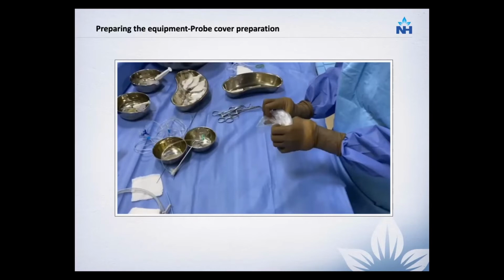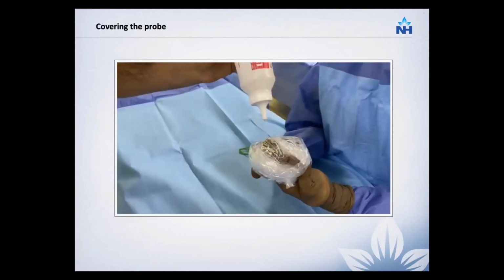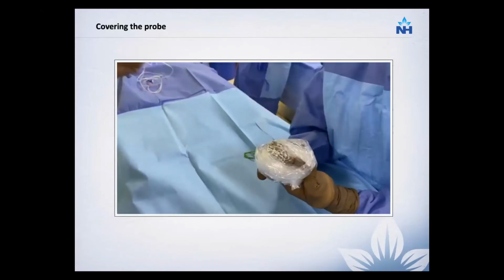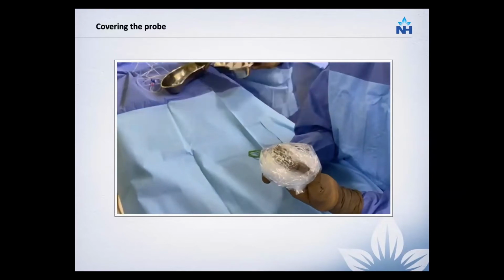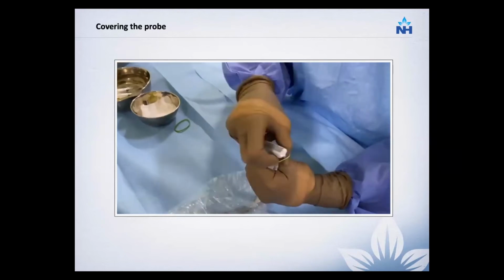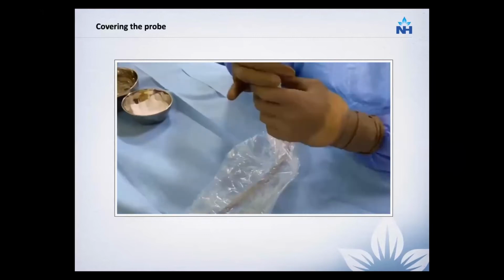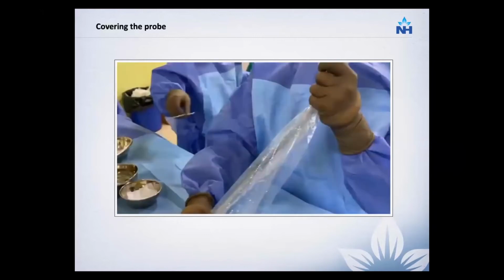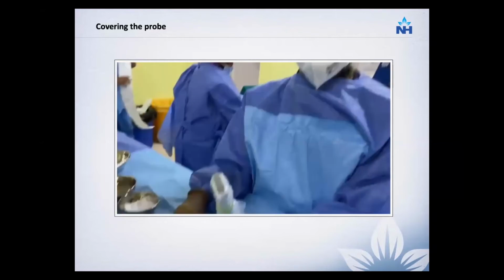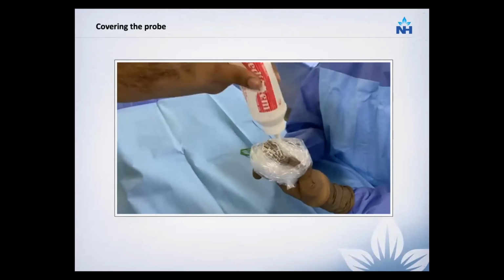But here, we don't get the sterile jelly packets. So the assistant has to pour the jelly in. That is how I invert the plastic cover. And I make sure that when the assistant is pouring in the jelly, and use of liberal jelly is very important, it should not splatter over my gloved finger. So the jelly bottle has to be full, and the assistant has to be really gentle in squeezing the jelly out onto the probe cover. Cover the probe as well as the plastic cover with jelly.